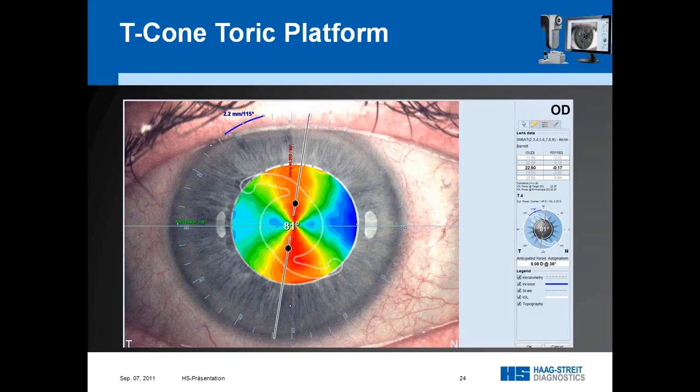Alternatively, you can also tell iSuite to provide the incision always at a fixed location, either superior or temporal, whatever your preference is. And if you go for an optimized incision, you tell iSuite the range you're comfortable cutting in.